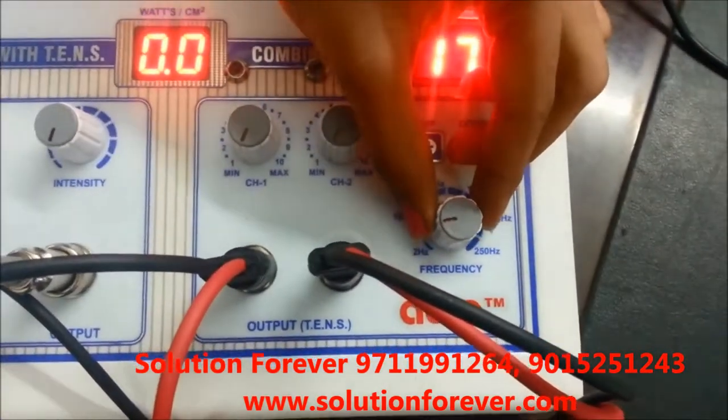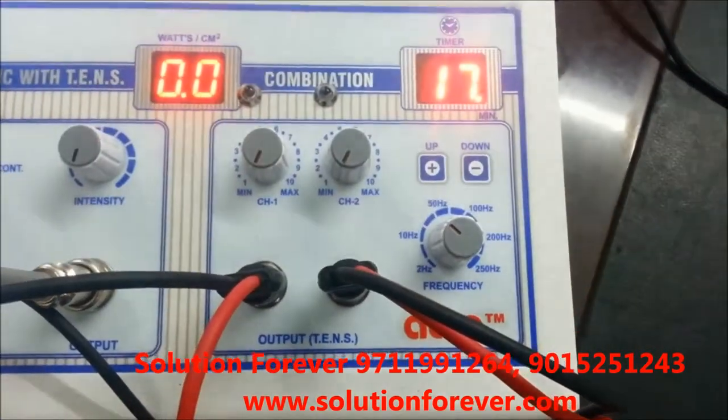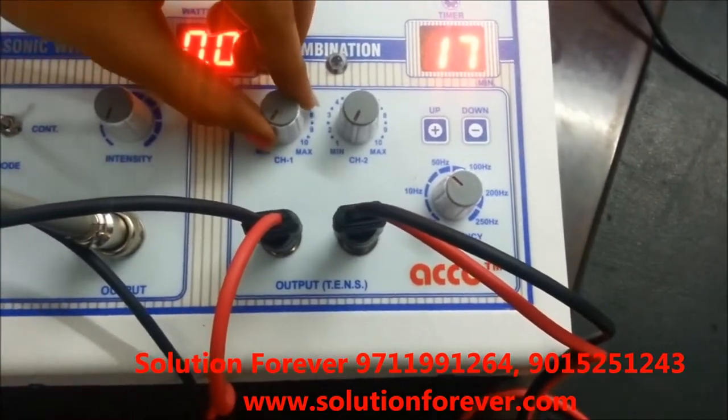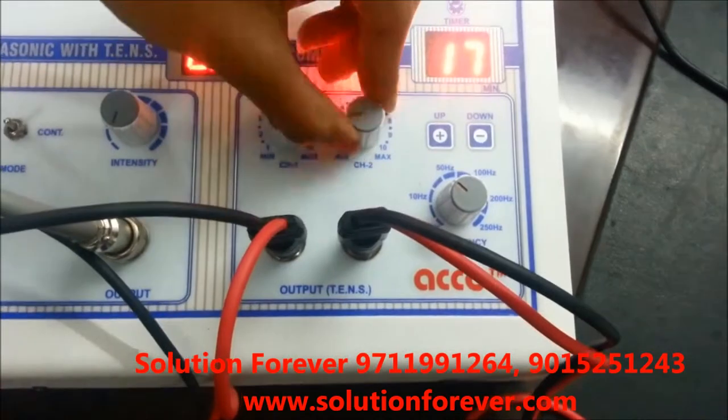Now set the frequency as per your requirement. Now increase the intensity as per your need — intensity channel 1, intensity channel 2.